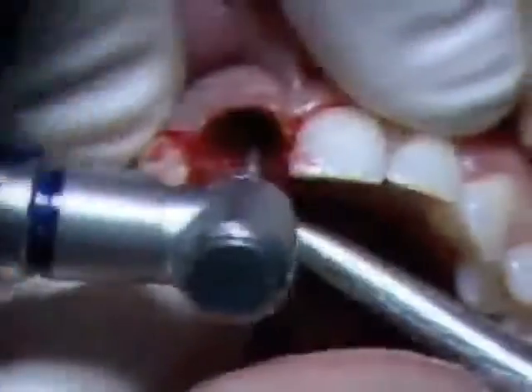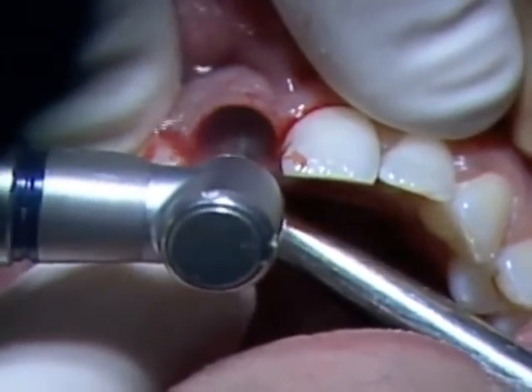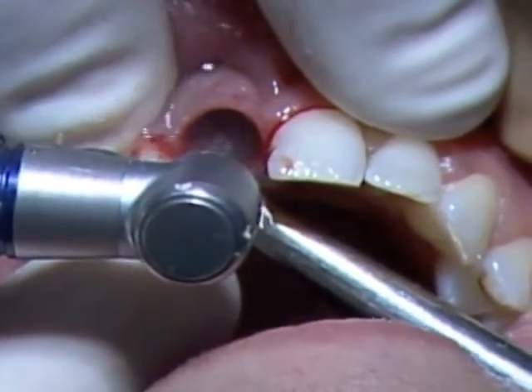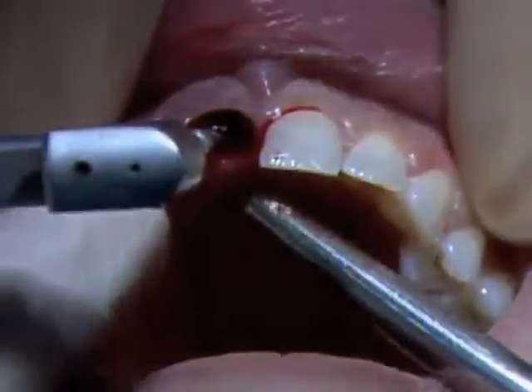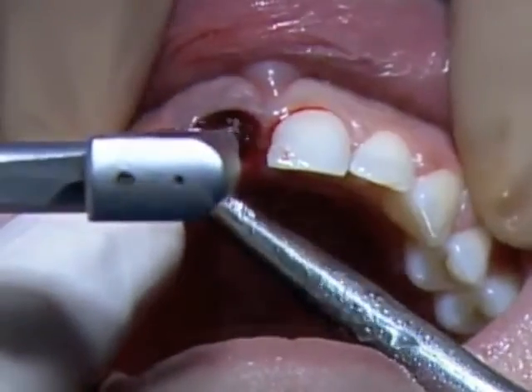Next, we will use our round burr in order to create a step more palatally to direct our pilot drill. The pilot drill I like to use is a 2.3 pilot drill.